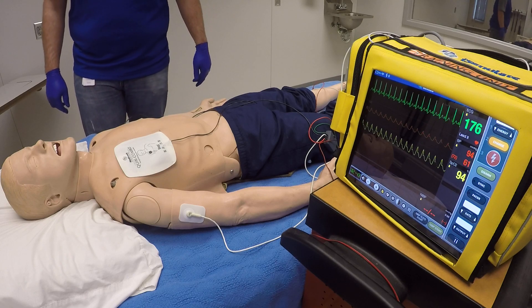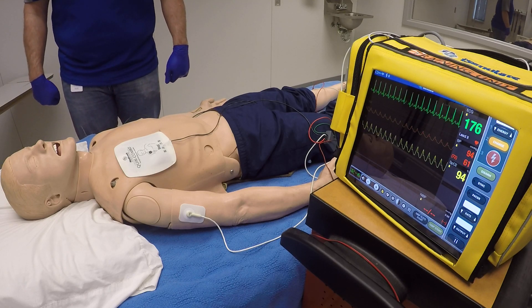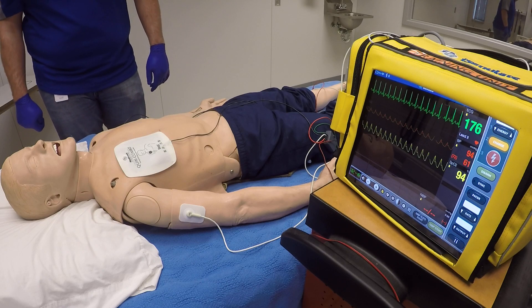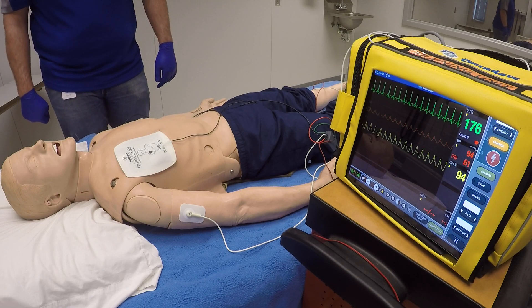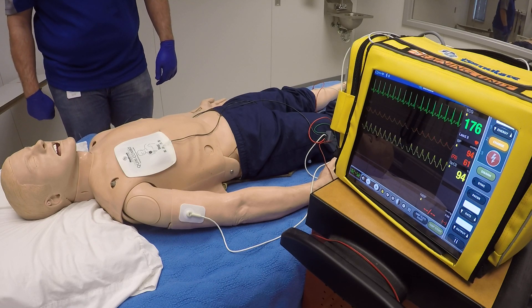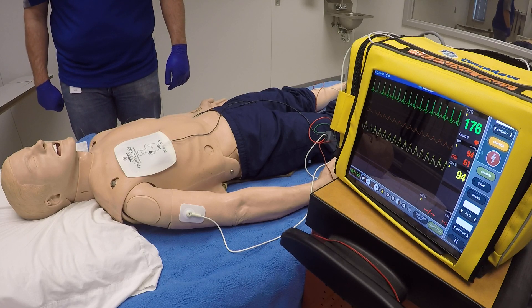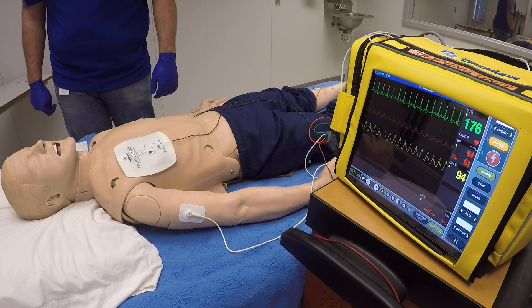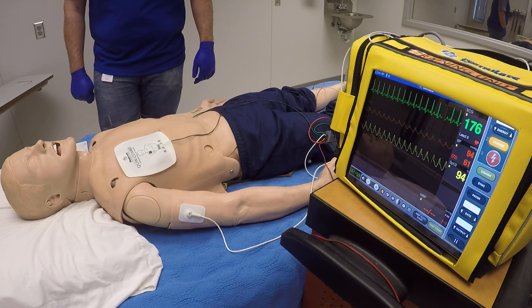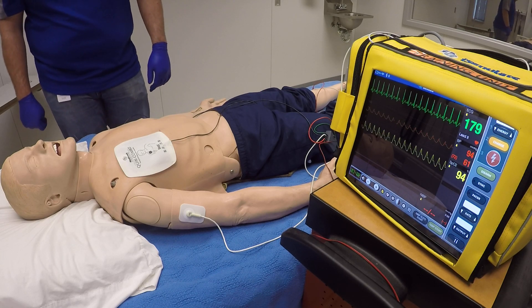You also want to make sure that your patient is not laying in a puddle of water, there's no metal laying across the patient, and nothing that might cause a spark — no gasoline or any combustibles. Also, if there are any hyperoxygenated areas, you may want to consider removing the patient from that because it can be very flammable.